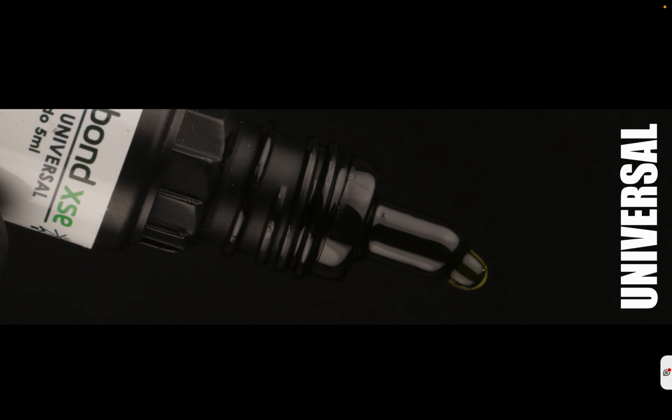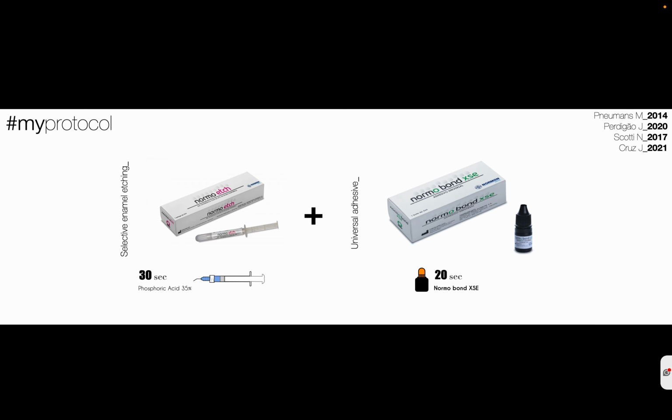And regarding the adhesive system, I normally recommend using a universal one. Why? Because they are very convenient, just one step, and very polyvalent for this kind of restoration. So normally this is my protocol: I etch the enamel 30 seconds with orthophosphoric acid, and then I apply an adhesive that normally is universal.